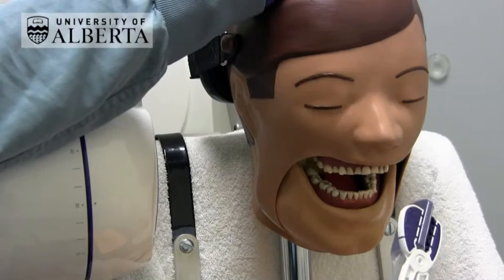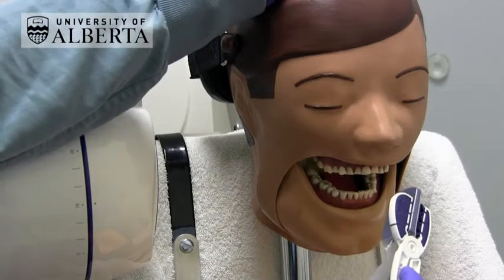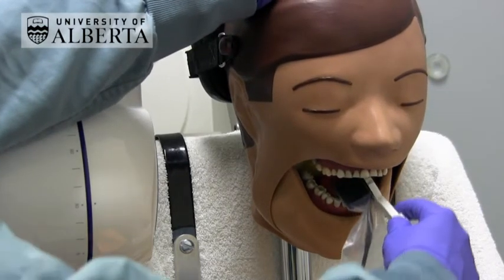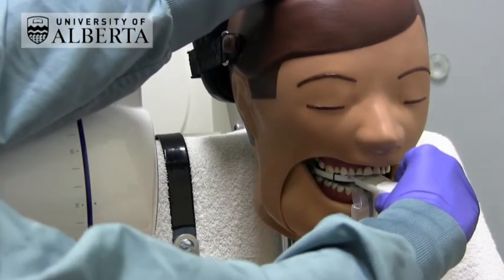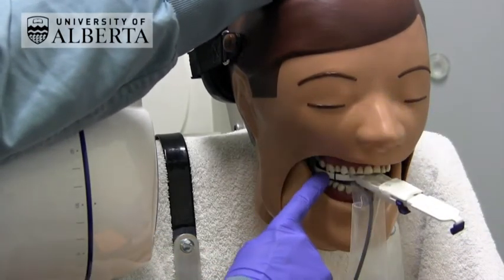For lower posterior periapicals using a sensor, place the sensor behind the mandibular teeth of interest like this and get the patient to close together again on the widest part of the bite block.